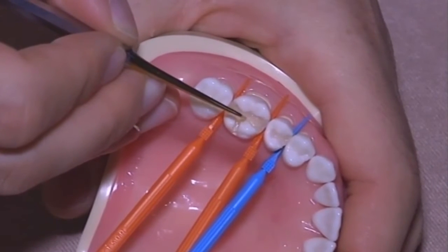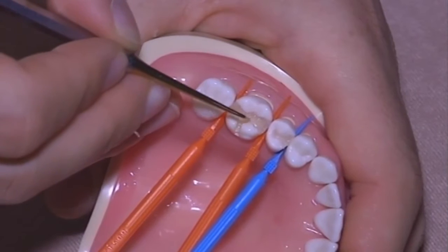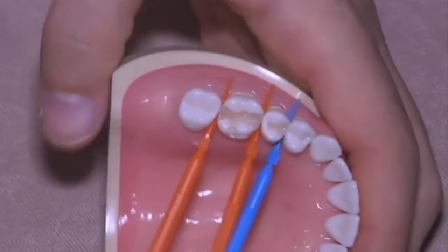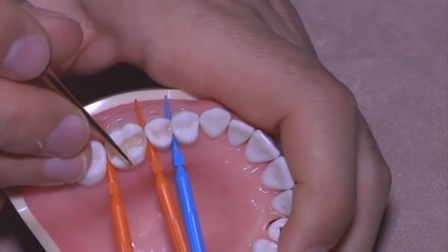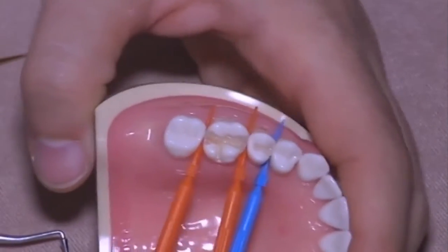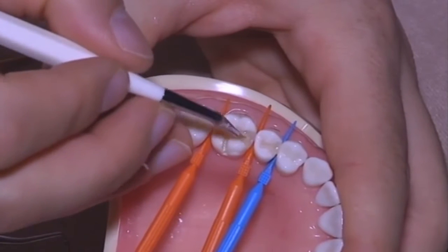Here we have a little bit of too much dentin. And thus you can move it. And then you come back again with the brush.